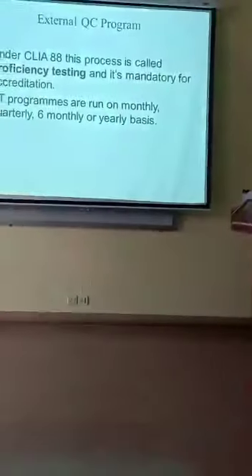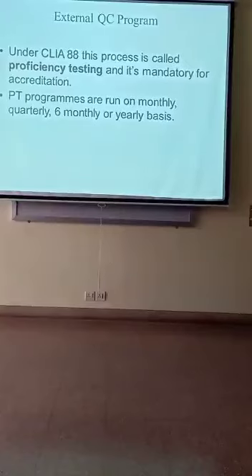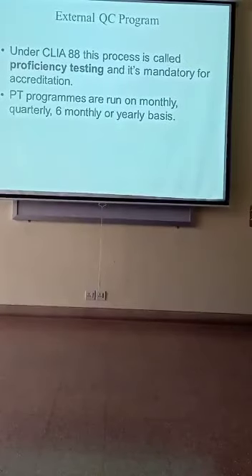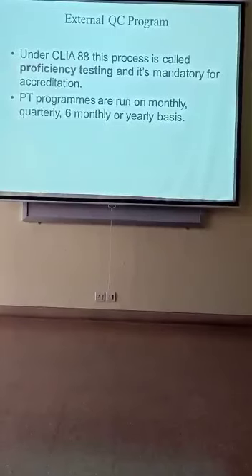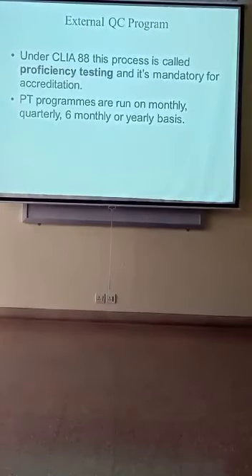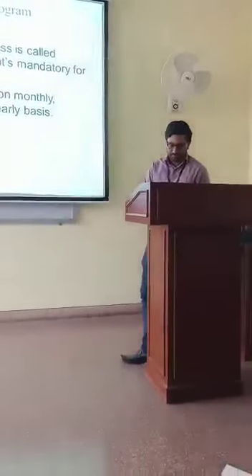Under CLIA 88, this process of external QC program is known as proficiency testing, and it is mandatory for accreditation. And the PT programs are run on a monthly, quarterly, 6 monthly or yearly basis.